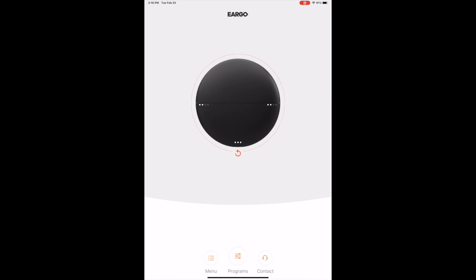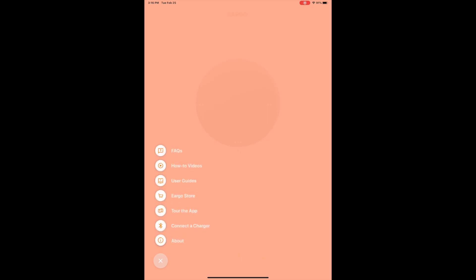Or something that they should integrate into this app, and I would probably put it into the menu system over here, is the ability to essentially set up an alert. So let's say you go to put your Ergo Neos or Neo Hi-Fis back into the case and you plug it in and you kind of drop it down and one of your Ergos kind of dislodges a little bit from its connection.